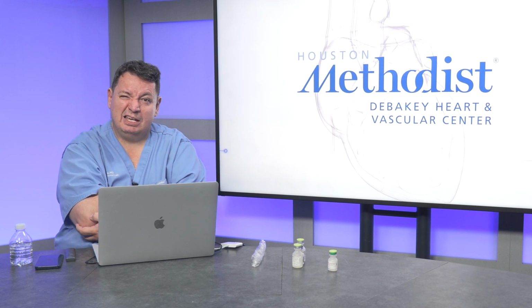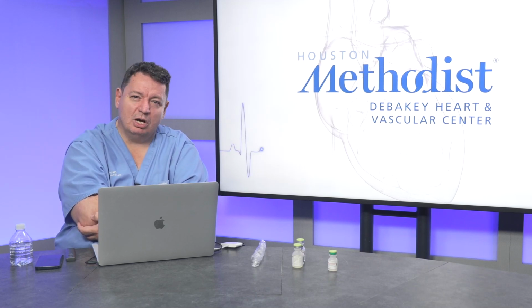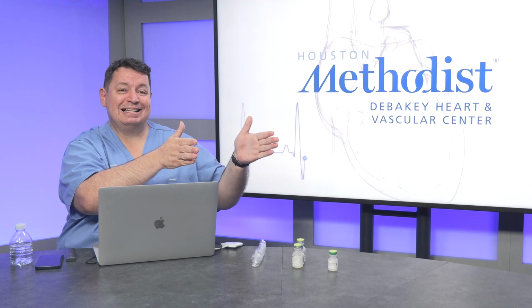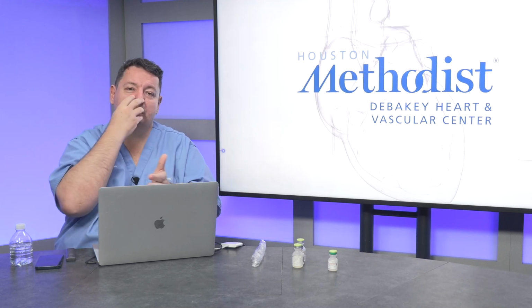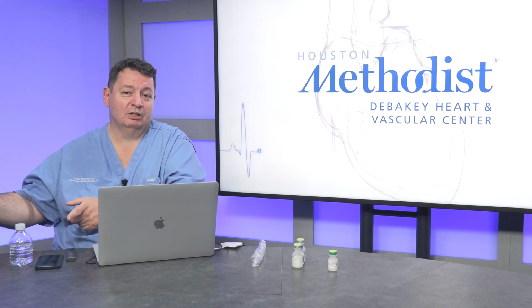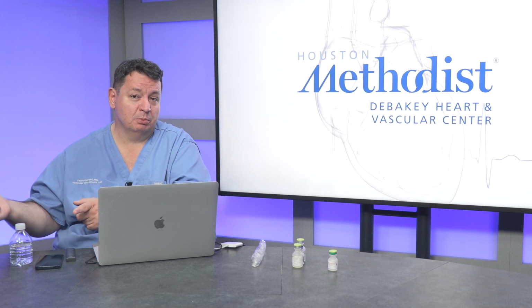In the last case report I think we prepared and are ready to submit, we counted about 20 without oxygen and it became 2 in a 10 minute interval. So what we did, you establish a baseline before you do the oxygen inhalation. You do the 10 minutes with oxygen, and then you remove the oxygen and go back to the no oxygen level, to truly confirm that the oxygen really made a difference in this monitoring.